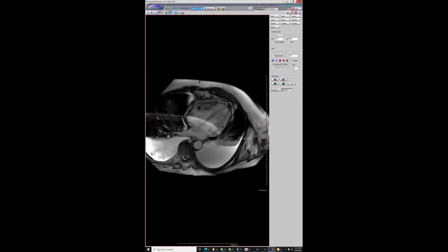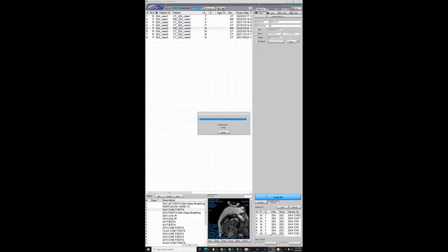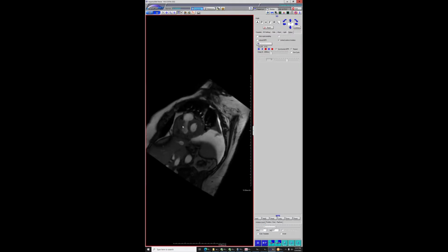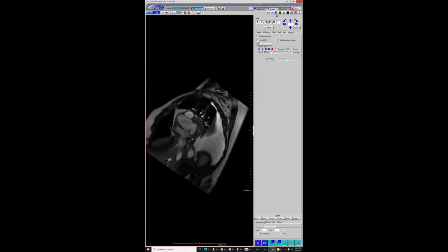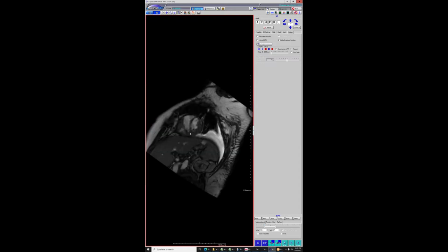So this patient just has now raging pericardial constriction from this very necrotic, ugly tumor kind of invading out from the wall, from the RV itself into the pericardium. Let me show the images. So here you can see the tumor, which is now more in the wall of the RV, but now really kind of throughout the pericardium. You can see all this tumor in the pericardium all around the heart. Here's that septum kind of having the nice wiggle.